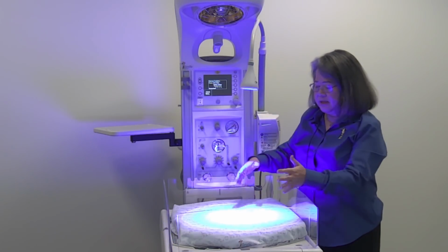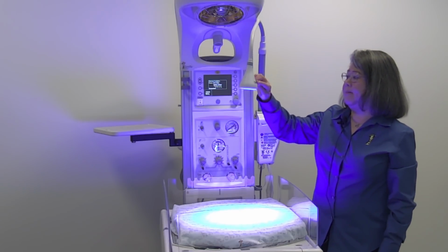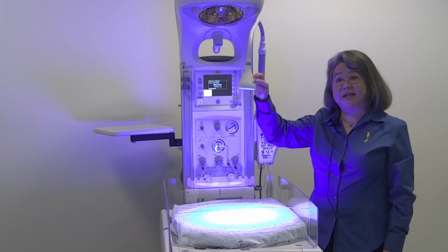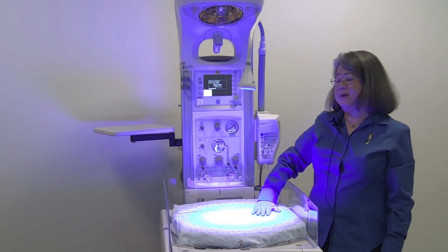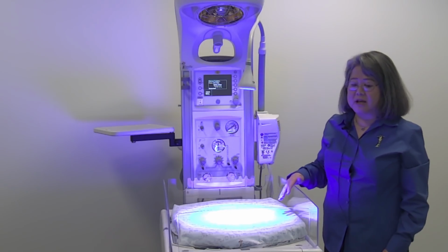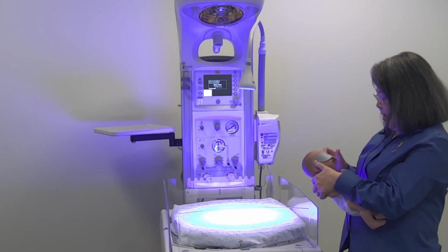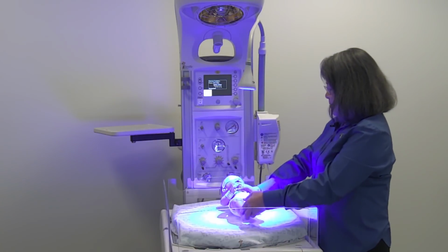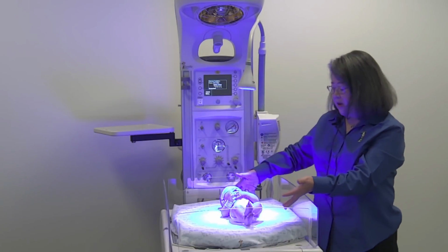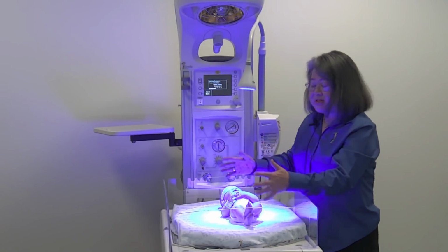Look at your circle, you still have your good irradiance on the mattress. And next point, third point, is being 38 centimeters from the patient, and 38 centimeters is roughly 15 inches. So if I have a good sized baby like this one, that circle will probably meet our needs pretty well. So with his eye patch on, the little baby is placed here, and he's covered very well here. Now, suppose he was an 11-pounder and he's occupying most of the mattress.